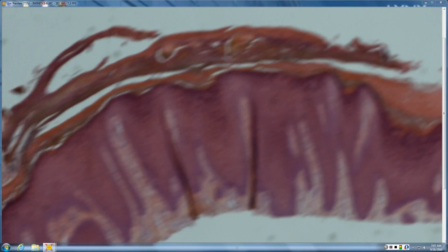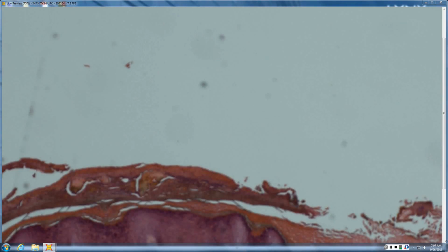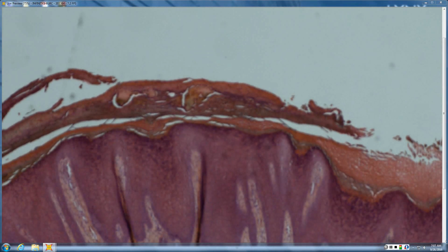And then if you're lucky, somewhere like maybe here is where there's actually a hair follicle or something. That's what gives you that hairy palm sign, which you shouldn't have acral skin and then have hairs in that location. So all that goes against it being psoriasis. And then you have hypergranulosis, which usually granular layer is lost with psoriasis. And then you maybe have a little bit of an infiltrate, but not a whole lot. And so that's kind of the same as psoriasis.